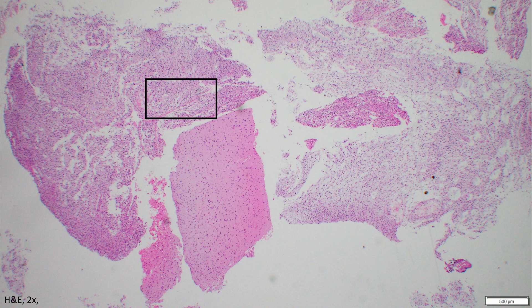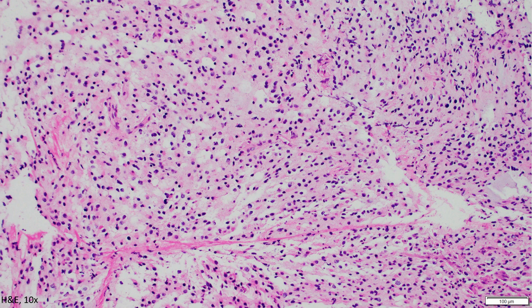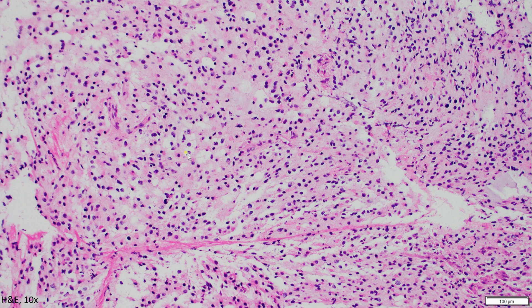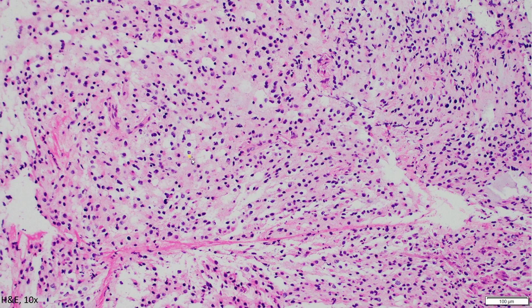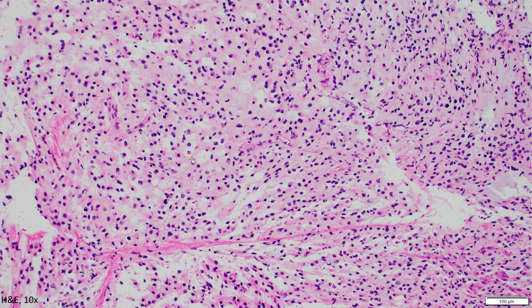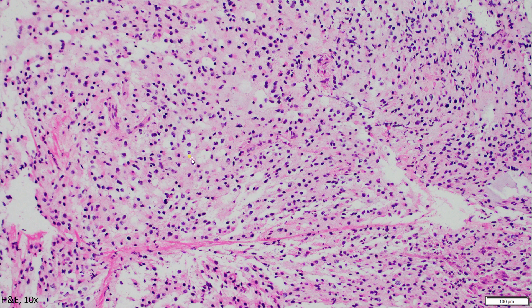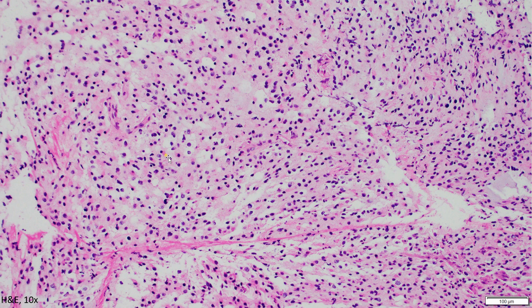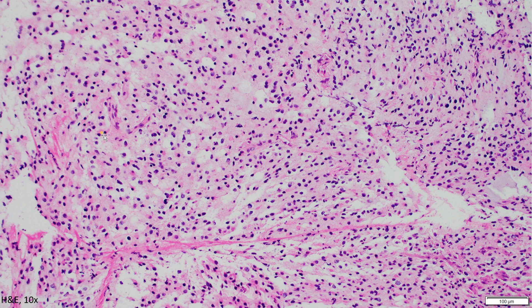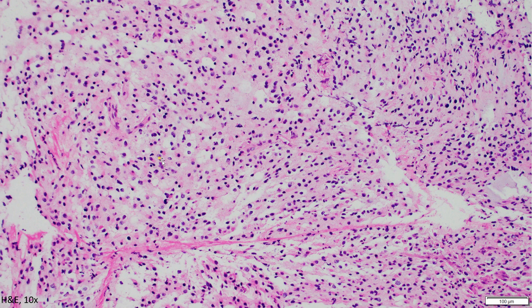If we go to higher power and look in this area, we can see that there are some regions where the cells have perinuclear clearing — around the nucleus there are cleared-out areas. This is an artifact of fixation that you can sometimes see in oligodendrogliomas as well as other glial tumors. In addition, there are atypical glial cells that have these little pink bellies, reminiscent of mini gemistocytes — 'mini' meaning small-looking gemistocytes.